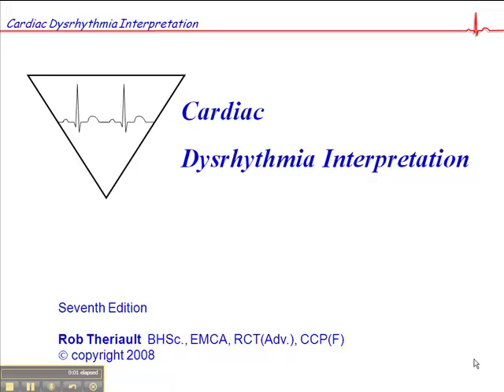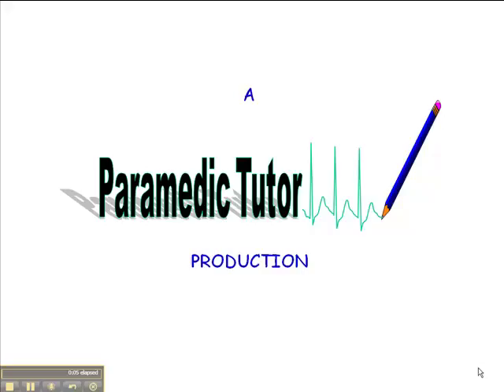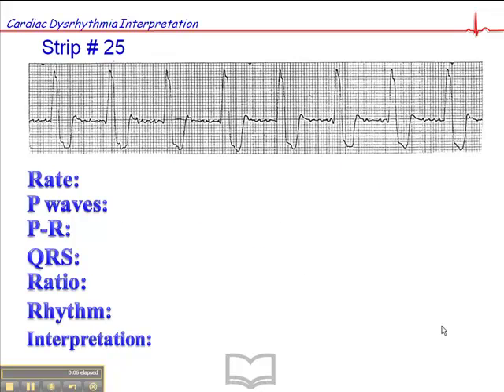We're on page 97 now, and this is ECG exercise number 25. This is another interesting rhythm. Let's start with the heart rate. The heart rate is approximately 75 beats per minute, and there are no clearly discernible P waves.